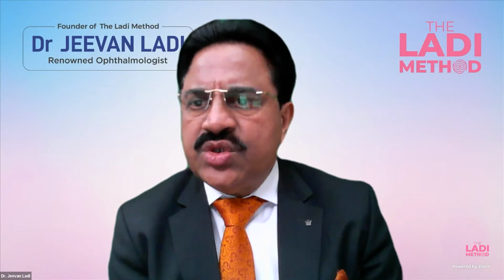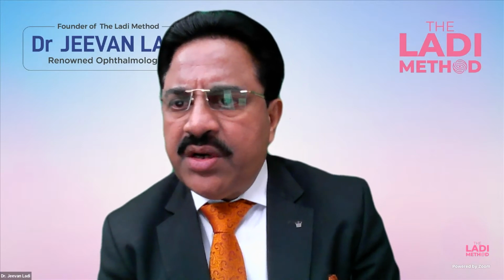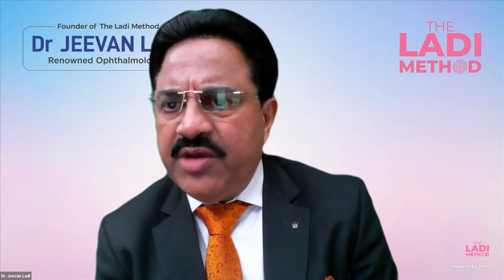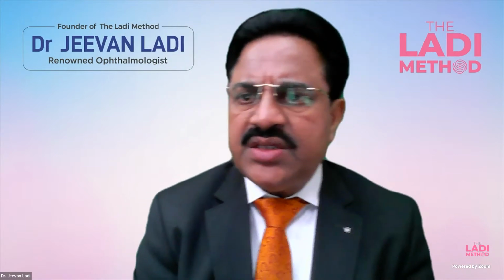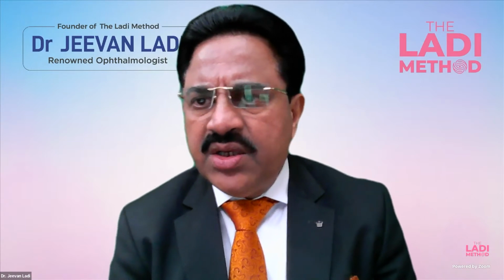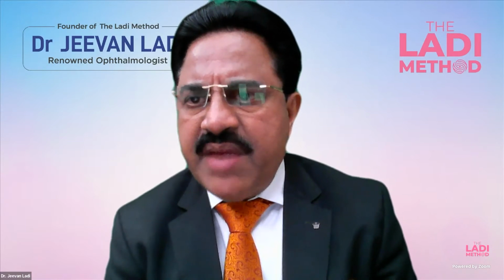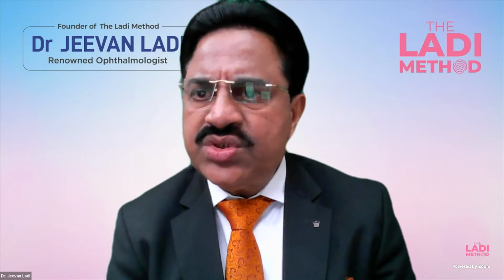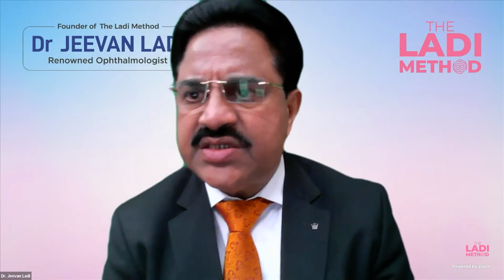There is a question from Dr. Kaustubh Ranade. Why haven't you considered lens thickness? Lens thickness does play an important role in a final outcome. Absolutely right, Dr. Kaustubh Ranade. Why only lens thickness? Even white to white is a good parameter to be considered. But if you go back to the Barrett Universal 2 formula and check, the mandatory readings are axial length, keratometry, and anterior chamber depth. We used only this and did a study. You can do another study where you include a fourth parameter, lens thickness, and get back to us.